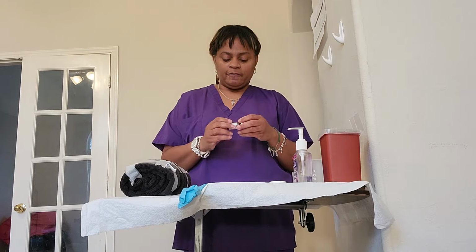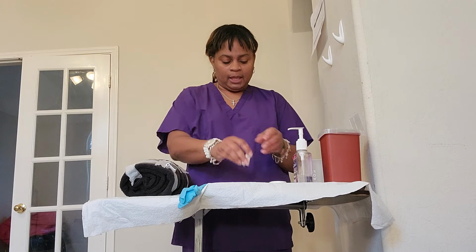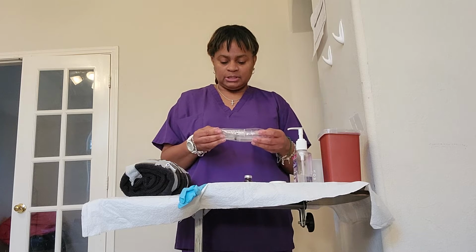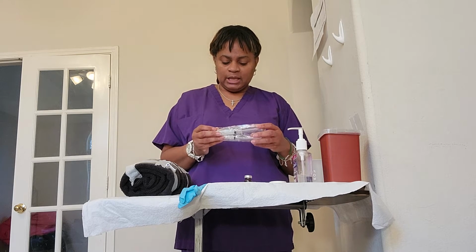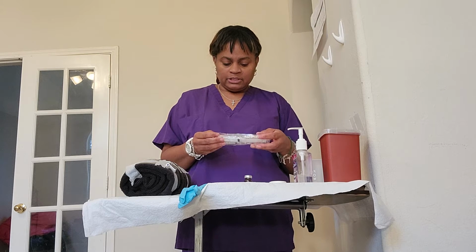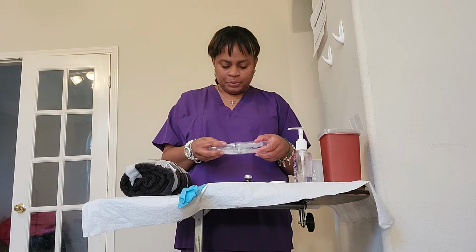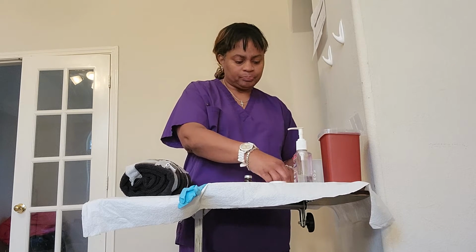Okay, we're verifying the expiration date 10/20/29, and I'm also going to verify the expiration dates on my flushes, and they are 0.9% sodium chloride flushes, and I have 2 of them. They are 10 milliliter. The expiration on each is March 1st, 2023. Now I'm going to do my second check of her medication, or the MAR.